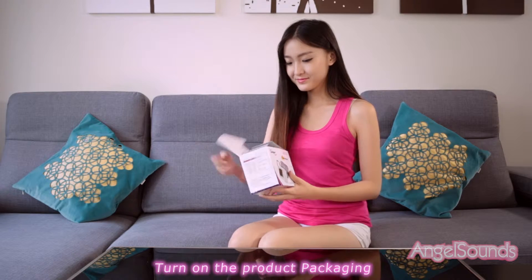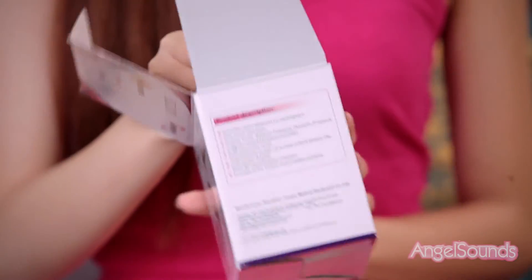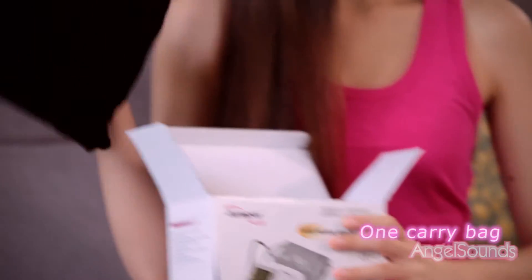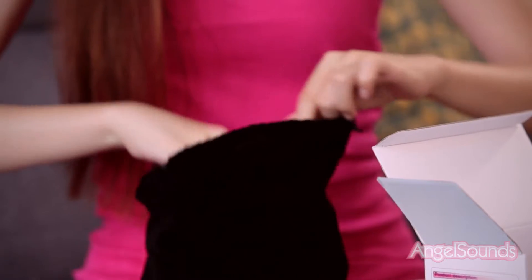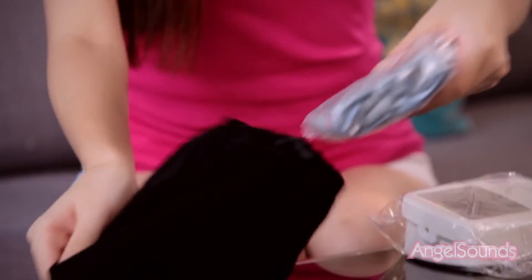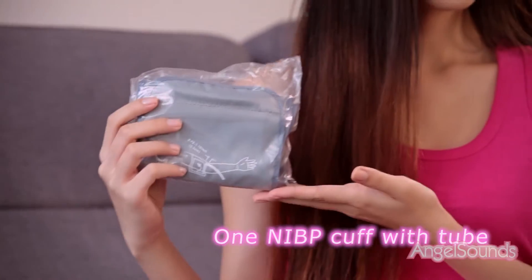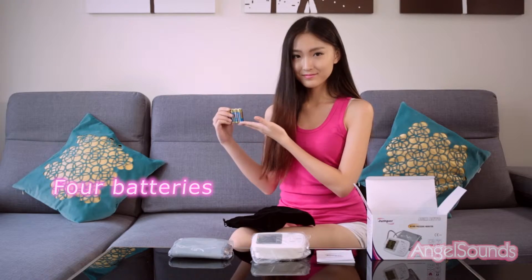Turn on the product packaging and check the packaging list: one carry bag, one user manual, one blood pressure monitor, one NIBP cuff with tube, and four batteries.